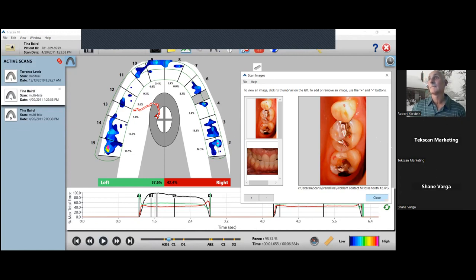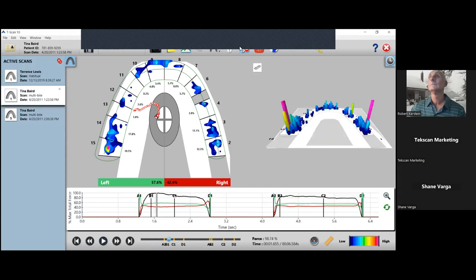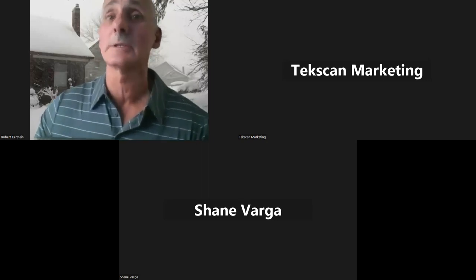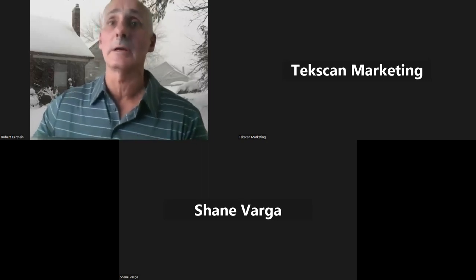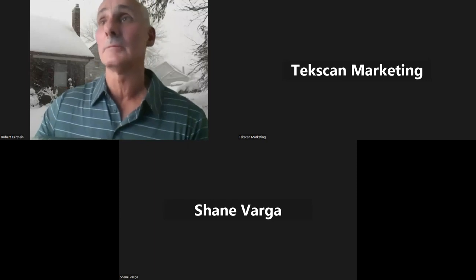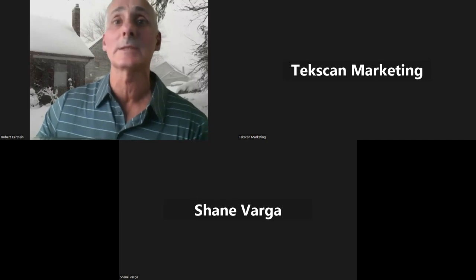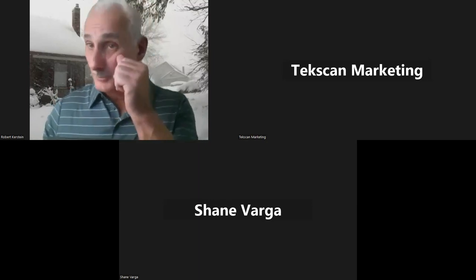So Dr. K, we had a question come in. The question is, when balancing the occlusion through incremental reduction, which arch do we reduce first, the upper or lower? It's a very good question. The answer is you can adjust either. If the patient has a problem tooth, it's probably best to try to adjust that problem tooth, unless you can't put pressure on it.